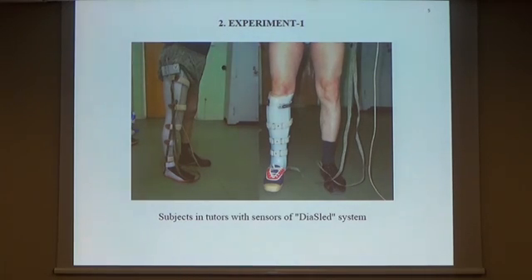The suite includes a set of tensometric insoles of different sizes, with about 200 strain gauges on each insole, the signals from which allow to obtain, remember, and display on the computer pressure distribution patterns under each foot, integrated loads, and so on. Here you see the sensors on the orthoses, which give the signal of distribution of underplantar pressures.